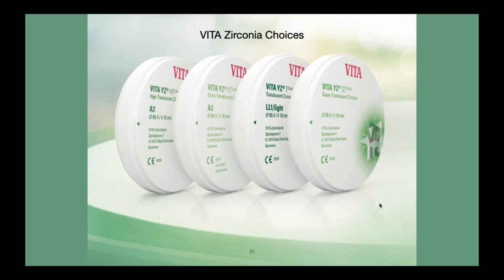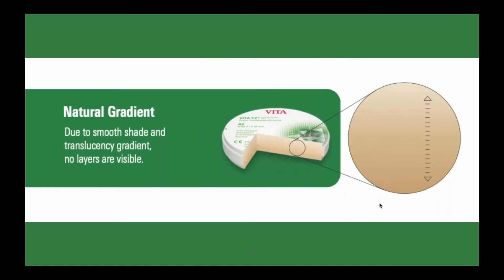So the VITA choices are basically a gradient, a natural gradient, which most of these pucks are. But it's how you lay these things in that makes a difference. So if you're doing the big smile cases and you're doing like a 1M1 or whatever, OM1, things like that, you want something that is just a gradual change.